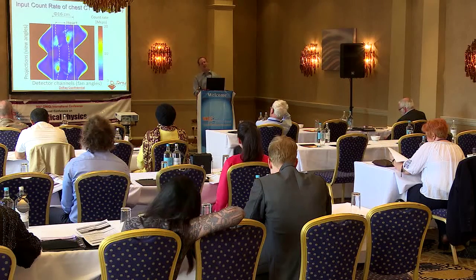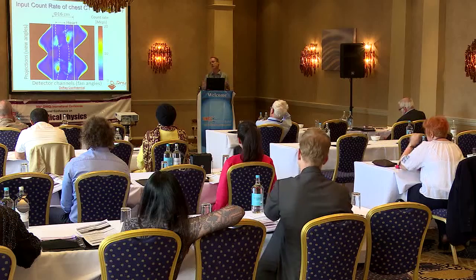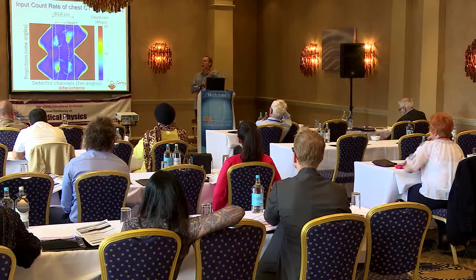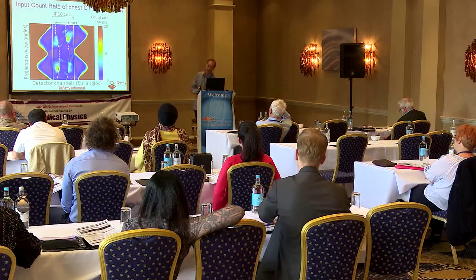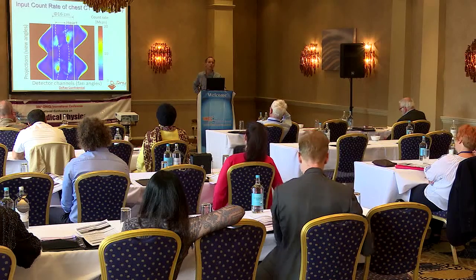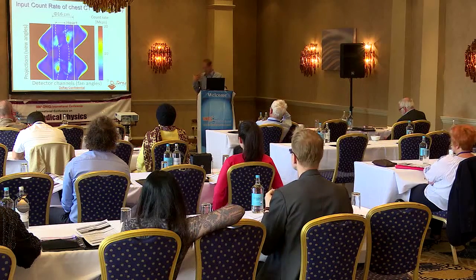And so this first system was sufficient for neck and for abdominal studies, but not sufficient for cardiac CT. In cardiac CT, the flux from the X-ray tube is much, much higher. The tube current is usually changed from 120 to 200 milliamps up to between 400 and 800 milliamps to be able to acquire an image fast enough to freeze the motion of the heart. And so we performed a Monte Carlo simulation using the standard cardiac MCAT phantom from Johns Hopkins to determine what the attenuated beam count rates are.